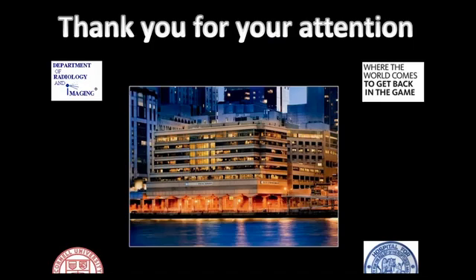Okay, so the first question is, I commonly see small facet joint effusions. Can these be considered normal, or are they always considered pathologic? Yeah, so small effusions are a sign that the facet is a bit irritated, but I don't think it necessarily means that they're symptomatic. I mention a lot of things in the body of the report, but when I go to the impression, I only put what I'm impressed with, what I consider a conclusion or synthesis of what I see. But small facet joint effusions by themselves are really not significant.